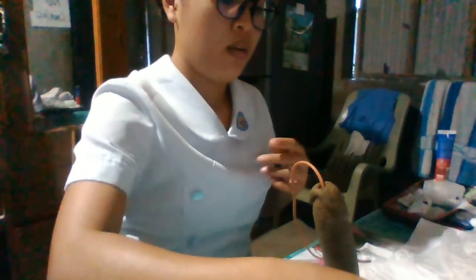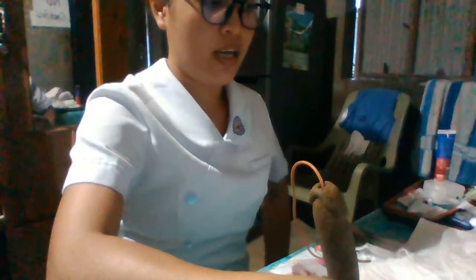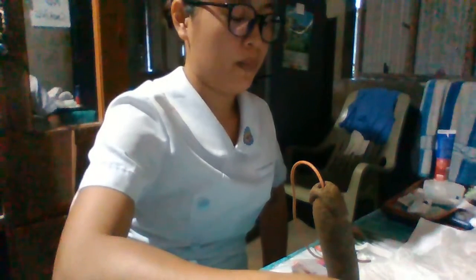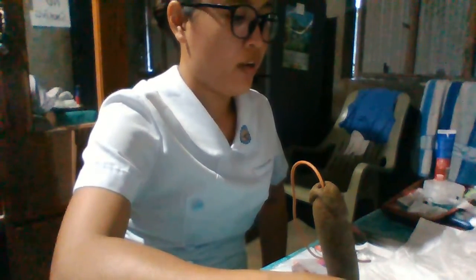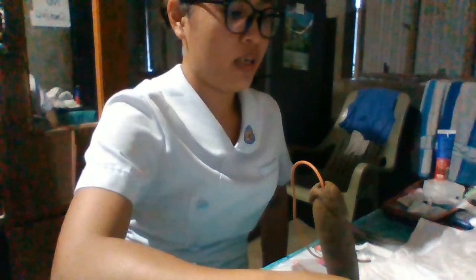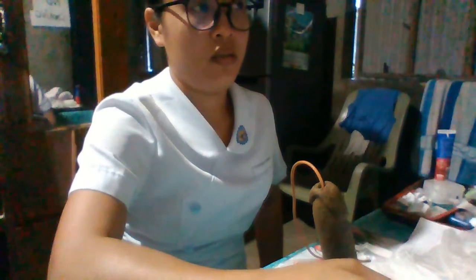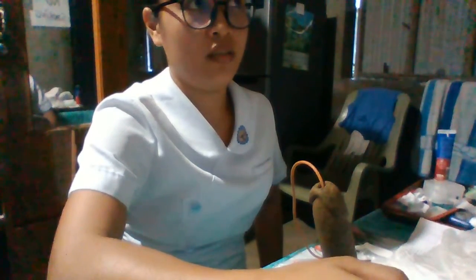Next, note the character of urine and assess the client's temperature, and record on the nurse's notes when catheter care was given, and the assessment of the urethral meatus and character of urine, such as the appearance and the color.